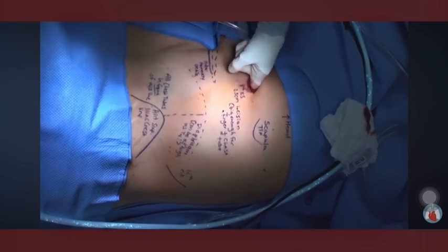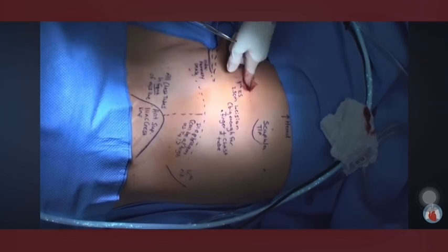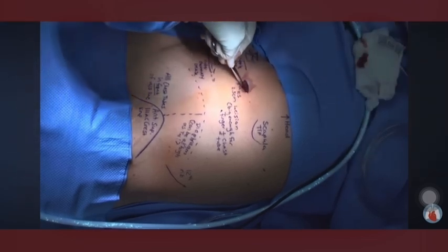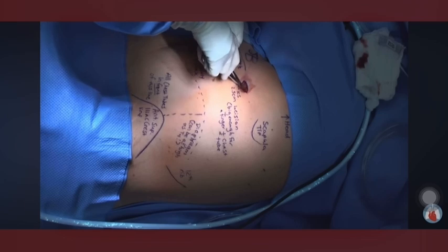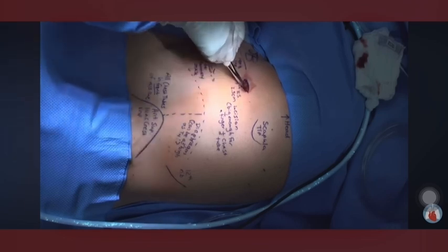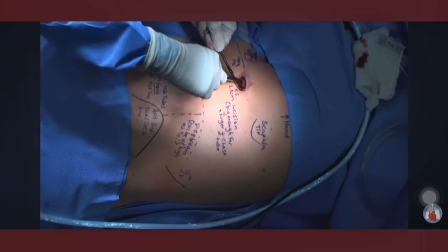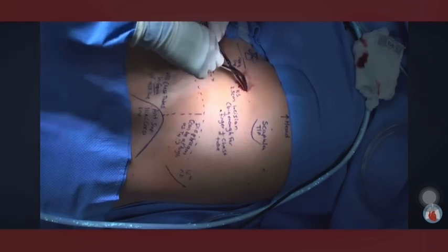The chest should be entered bluntly with a hemostat or curved Kelly clamp, or even your finger. Brace your dominant hand with your second hand to avoid advancing the clamp too far into the chest, risking injury to the lung or even the heart on the left side. Dilate the tract, starting at the level of the pleura, backing into the muscle, the sub-Q, all the way up to the level of the skin.